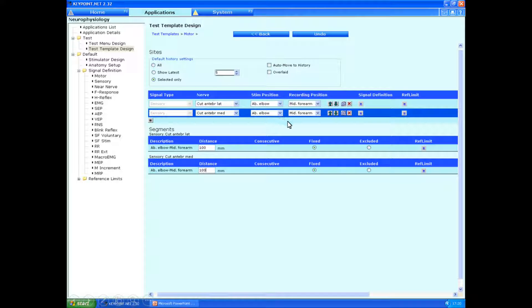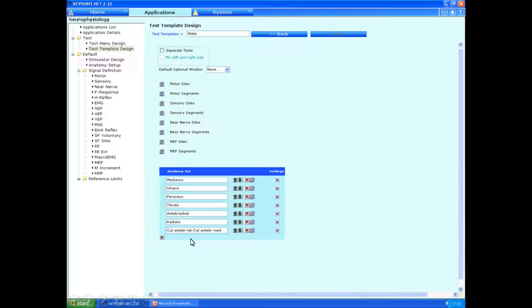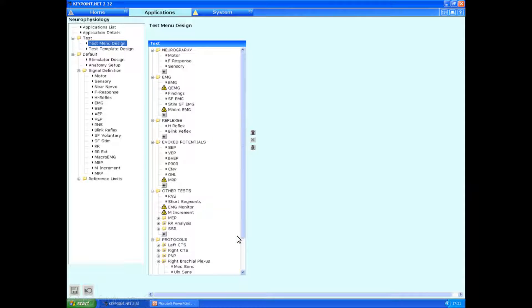And we've now added in the antibrachial sites as well. Again, you can choose if you want to put in a fixed distance or not, entirely up to you. But here we can see that the antibrachial sensory responses are now included.